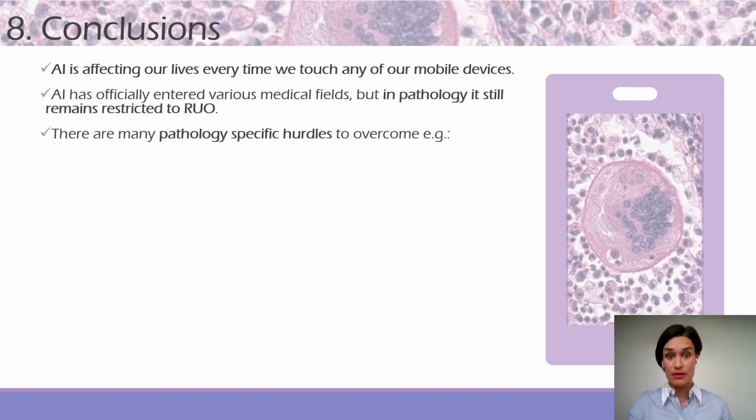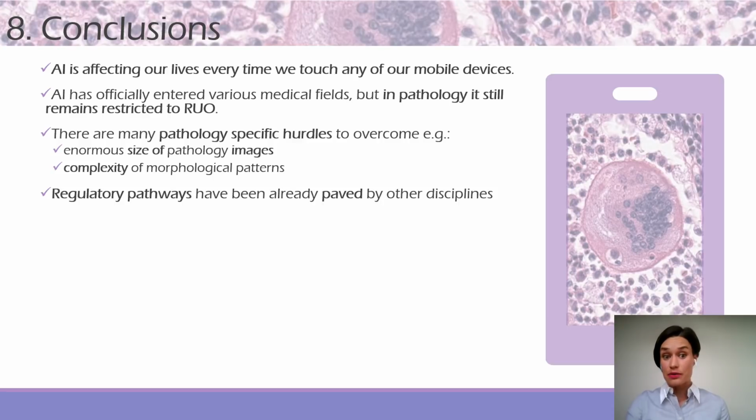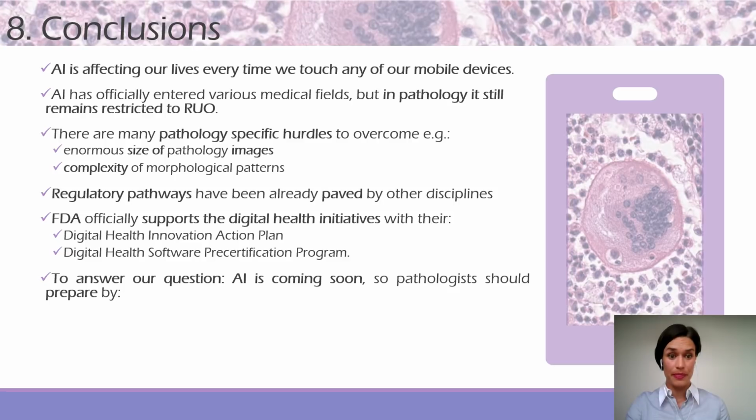There are many pathology-specific hurdles to overcome, the most important being enormous size of pathology images and complexity of morphological patterns. The regulatory pathways have been already paved by other disciplines, which is good, and the FDA officially supports the Digital Health Initiative with their Digital Health Innovation Action Plan and Digital Health Software Pre-Certification Program.